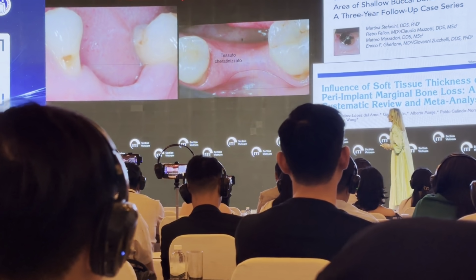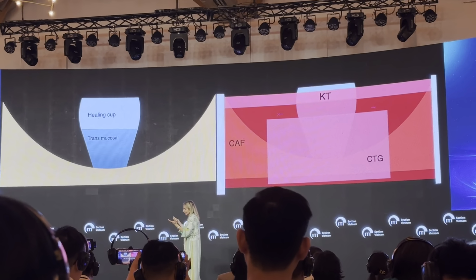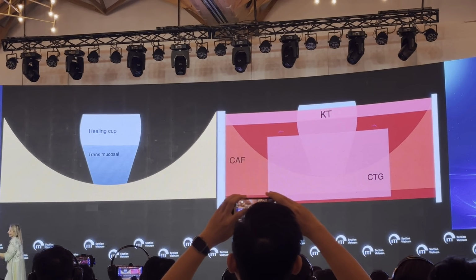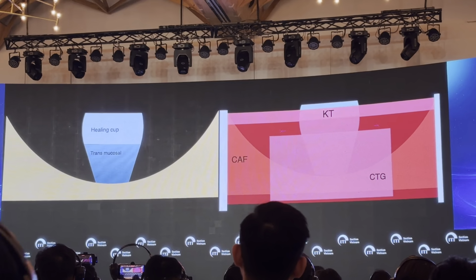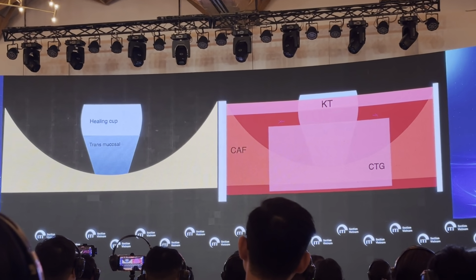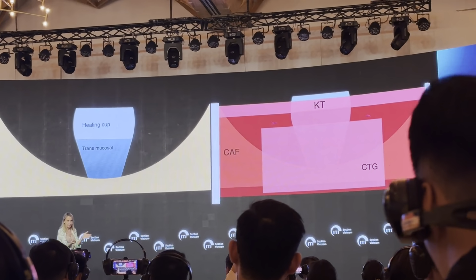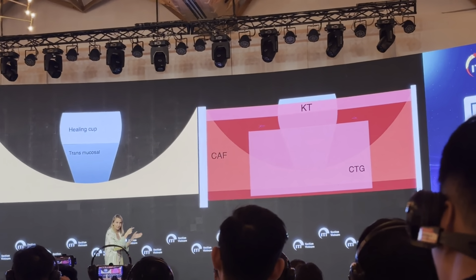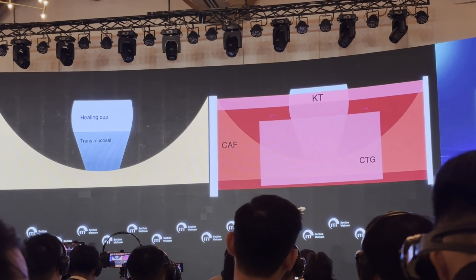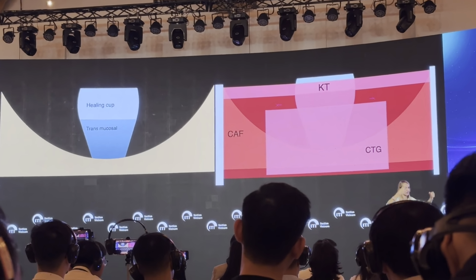So in these cases, the technique consists of the coronally advanced flap execution and a tissue level implant insertion that is going to be covered by a connective tissue graft that is going to be attached to the inner aspect of the flap, like during the immediate implant placement. Here we don't have the papilla because the edentulous area on the posterior side is flat, so I don't have papilla more coronal to suspend the connective tissue graft.